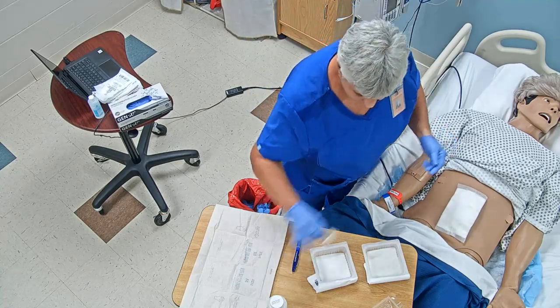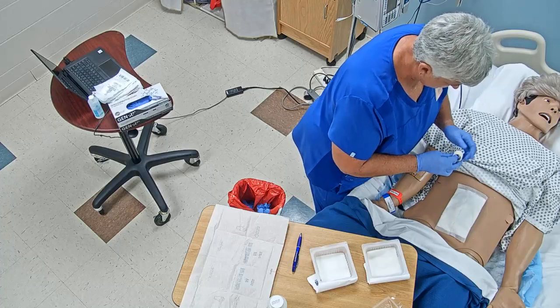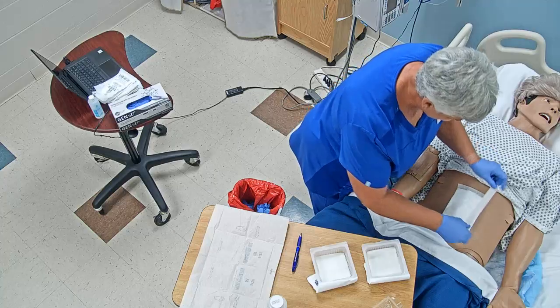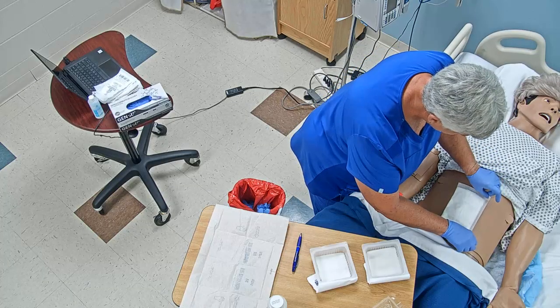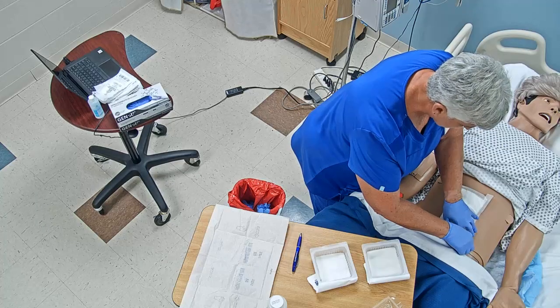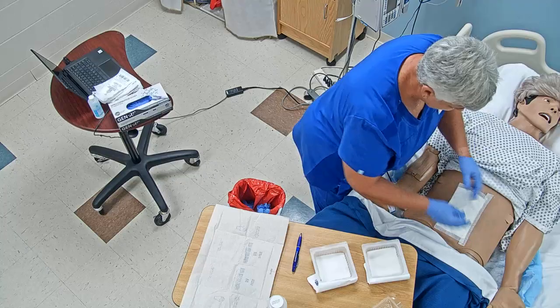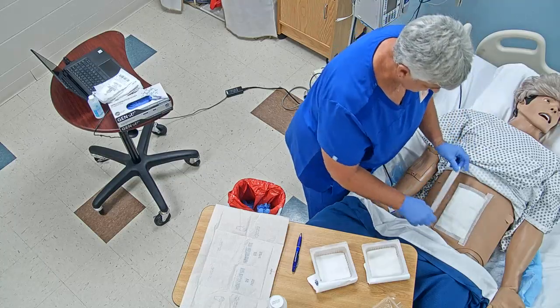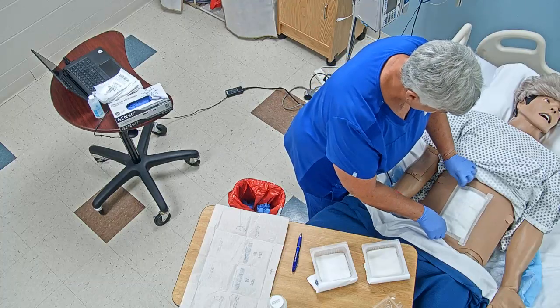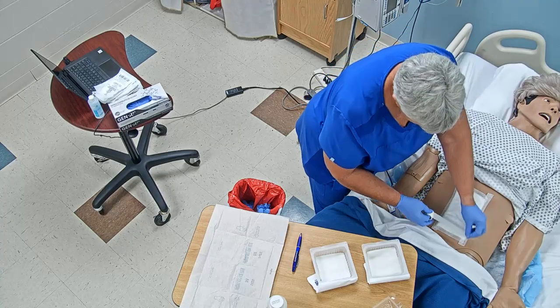Okay, I'm going to get my paper tape and we are going to tape it in a picture frame. And again, I had verified at the beginning if my patient was allergic to any kind of tape. Paper tape typically is the tape that most people do not have a problem with. And so we're going to picture frame it.